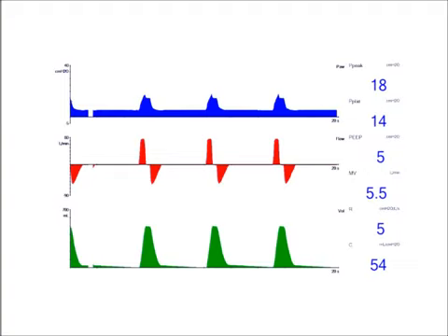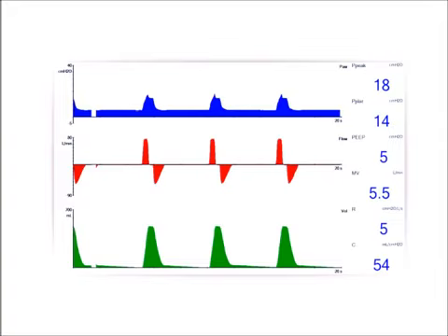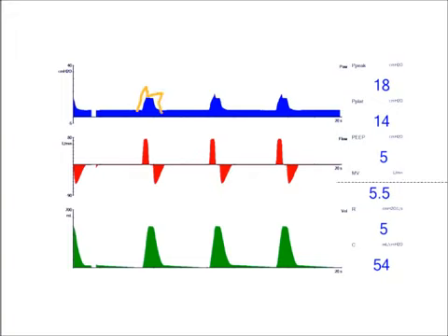Now, as you notice from this picture here, what we did is we did set an inspiratory pause. My inspiration starts, and then I have this little plateau phase here. So creating an inspiratory pause allows me to capture this measurement. By my measurements on the right side of the screen, here's my peak pressure of 18, and I have a plateau pressure of 14. I'm just going to draw an arrow on the waveform. There's my little plateau.